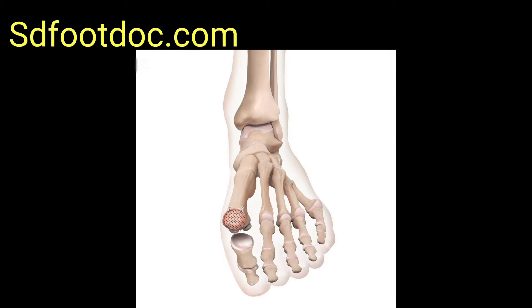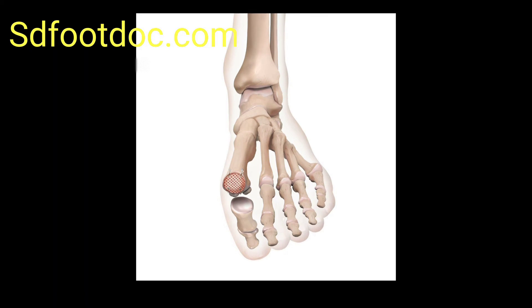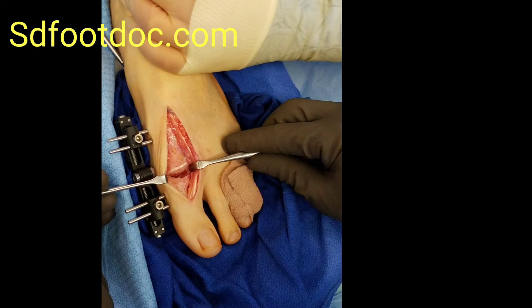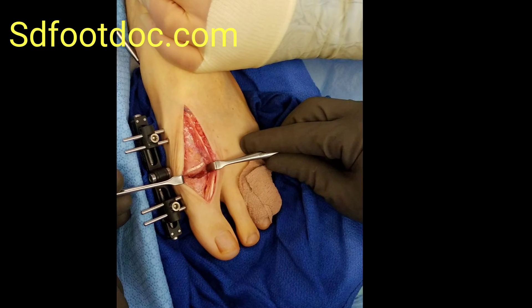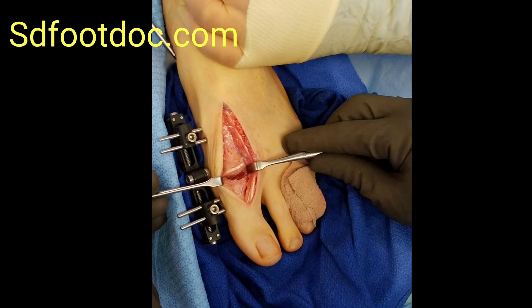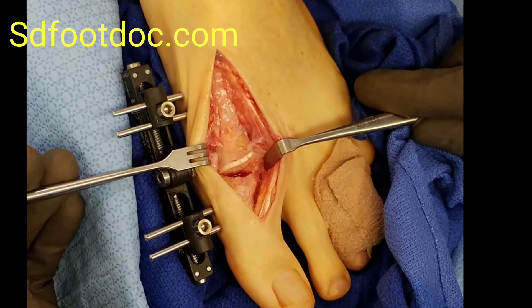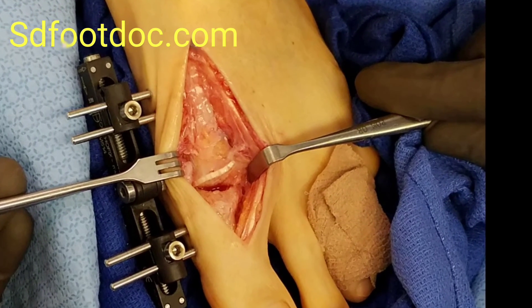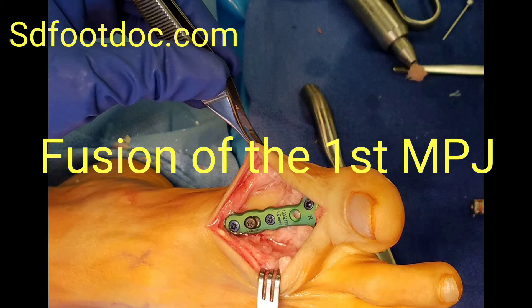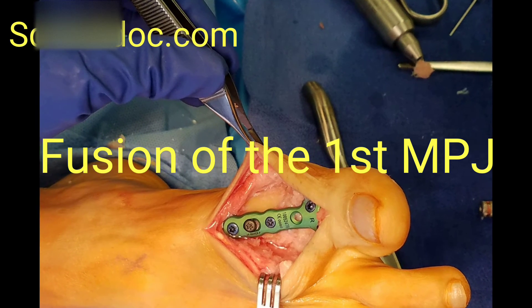As you can see, this is what it looks like when we place the cartilage graft. We distract out the joint so that the cartilage is not going to shift at all. It comes in different sizes and has good survivability. I've had patients over a year out who show that the cartilage has still maintained its form inside the joint via X-ray analysis. Here we can see how it looks in the final positioning — the patient has fresh cartilage back in the joint. This is what a fusion would look like; sometimes it is still necessary, but we want to stay away from these type of procedures.